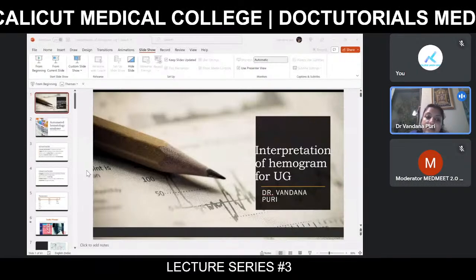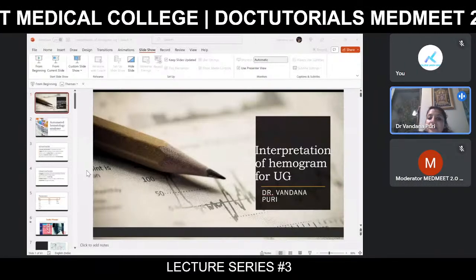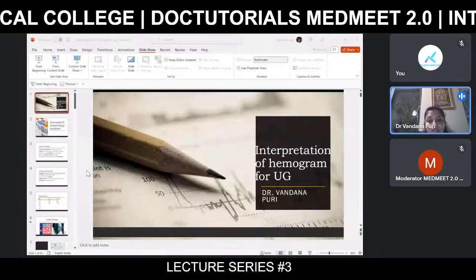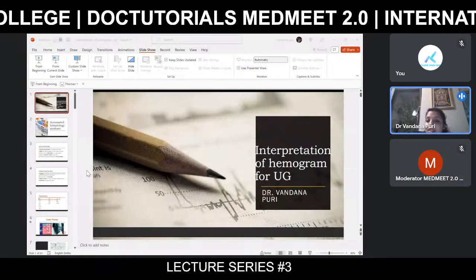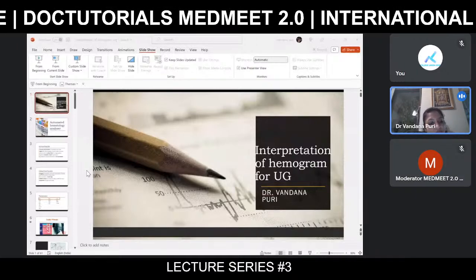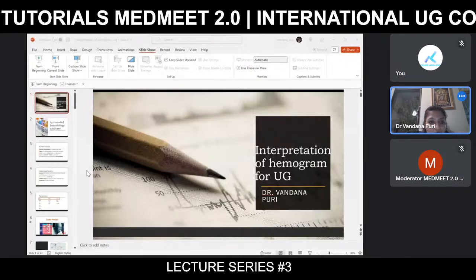That height is equivalent to the volume of the cells. And obviously, this is how the electrical impedance is used to identify the parameters. Now these oscillations which are coming, their height and number, are arranged according to the volume interval, and it gives you a histogram, which is very mandatory to be known.